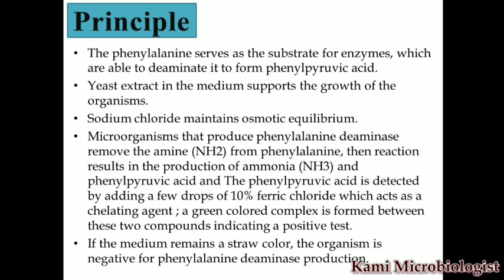So the principle says that this medium contains phenylalanine. The phenylalanine is actually the substrate for the enzyme, that is the deaminase enzyme. So when both substrate and enzyme react with each other, what will happen? It will deaminate, and after that we get phenylpyruvic acid. This is the reaction.